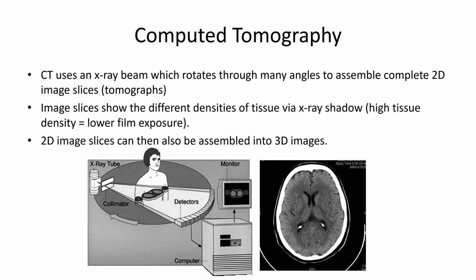So a CT scan is basically representing the tissue density from an X-ray beam's point of view. So something dense like bone is not going to let a lot of X-rays pass through, and that is going to be underexposed and show up as bright white. Less dense tissues like brain are obviously going to have a lot more X-rays pass through. And in order to get the proper contrast amongst slightly different densities of brain tissue, you have to adjust the windows so that you can look at the low densities of brain tissue.